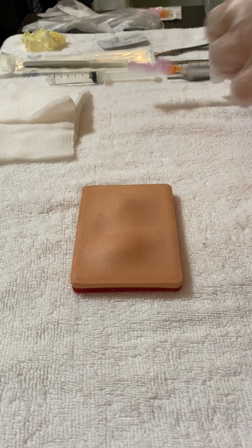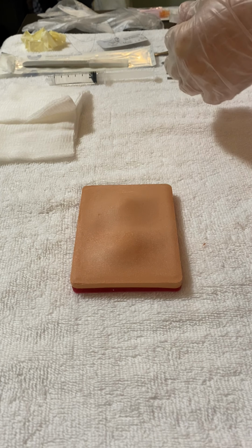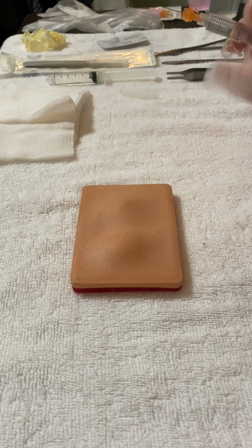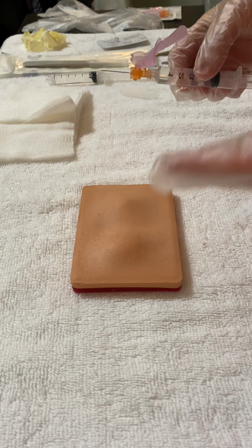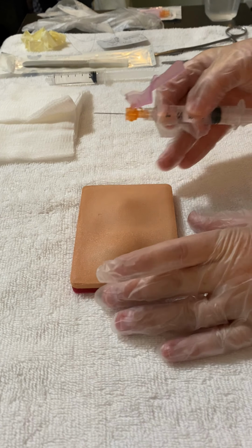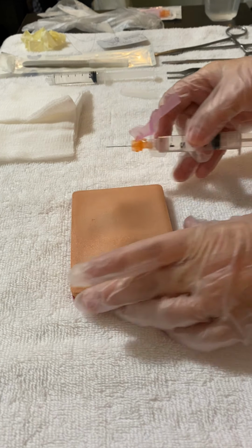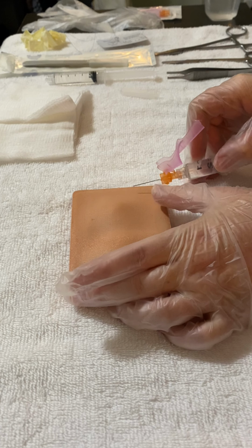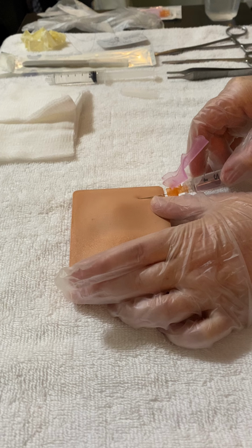And so at this point, I would start to anesthetize the area, and for simulation purposes, I'm using 1% lidocaine. So starting around the area, I would perform a field block, avoiding the center of the cyst.